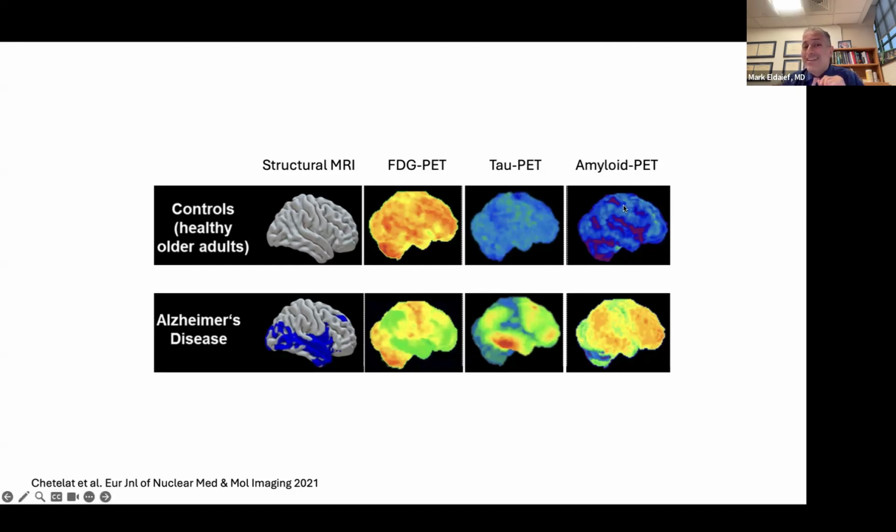Luckily, amyloid PET scans are now covered by Medicare, and that's a really great advance. So we can just send people to get those if we're worried about that. And the blood tests are the next wave, the next generation, where we might just get blood tests on people to detect their level of amyloid and actually even tau in their blood.